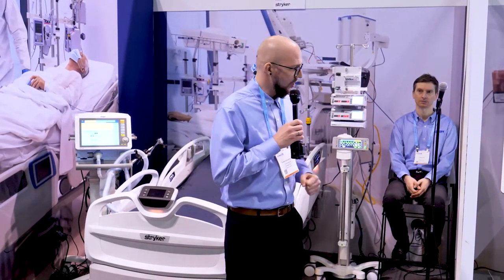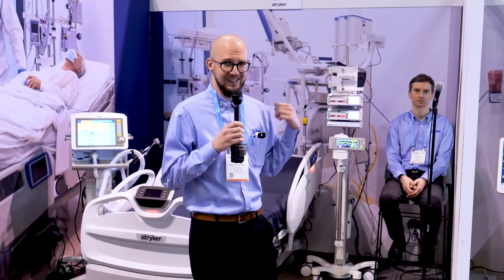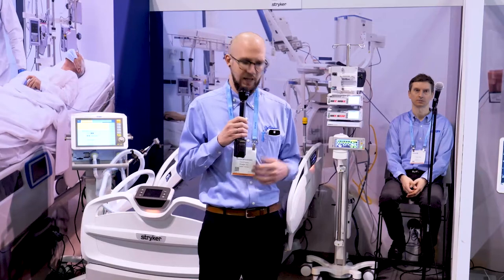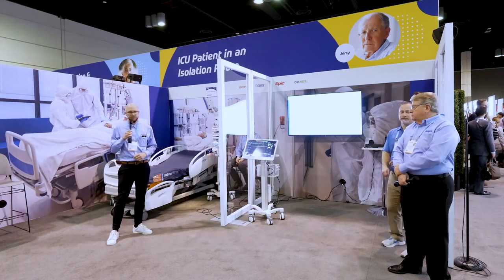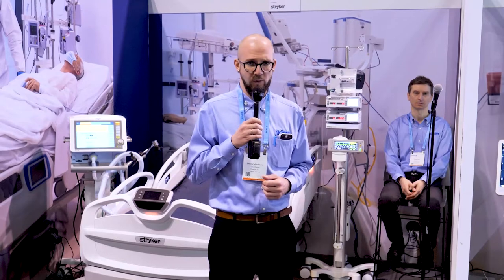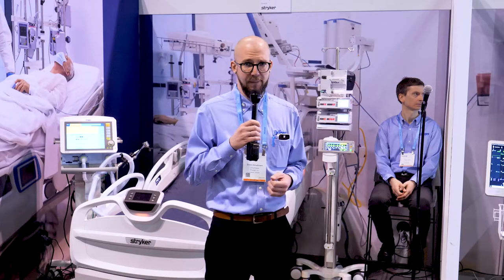The point-of-care cockpit is also usable for remote operations for devices inside the room. Any alerts inside the room will be forwarded to the ASCOM Myco 3 handheld and to the nurses' station ASCOM dashboard. There are also other rooms containing patients Jim, Joey, and Rose in different sections of our ward, so not only Jerry's alarms will be forwarded. Documentation of vital signs and the medical record will be done by Epic.